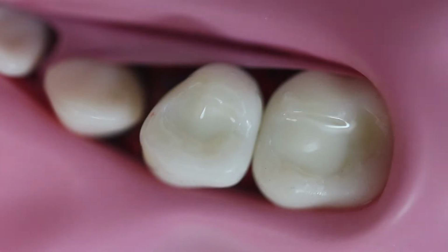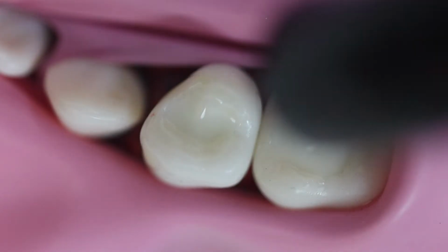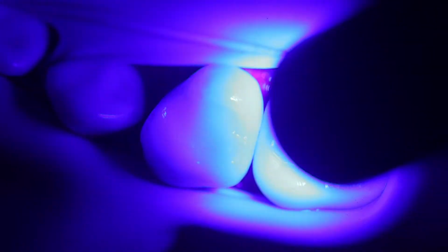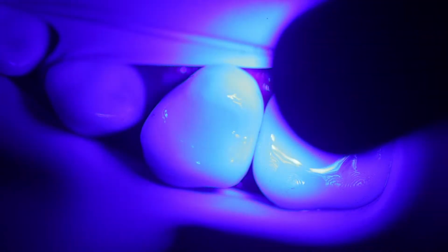Let it occupy those occlusal anatomy, and this is the time you are not using any instrument. Now we are going to light cure it after 20 seconds, and light cure it for around 30 to 40 seconds.